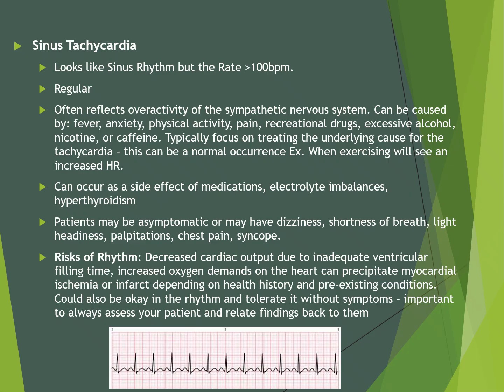It is important to always assess your patient and relate findings back to them. Our ICU colleagues will be just seeing a small snapshot of our patients by interpreting the rhythms, and it is really important that we are doing thorough assessments and relating their findings back to what we're seeing with our patients.